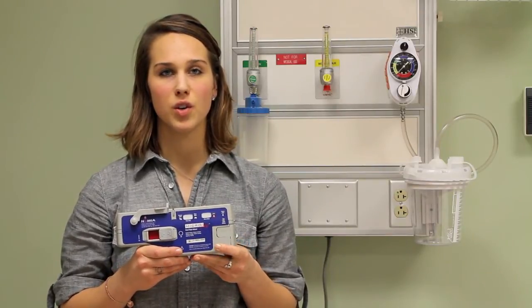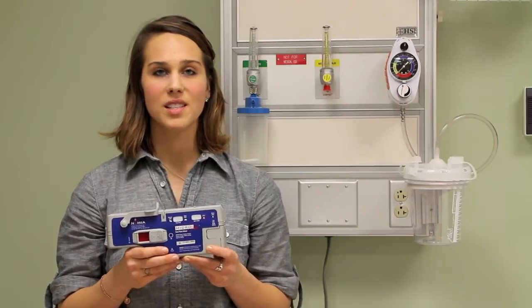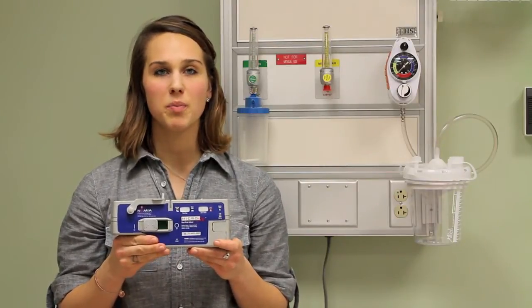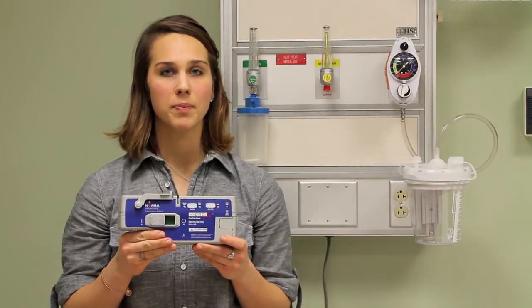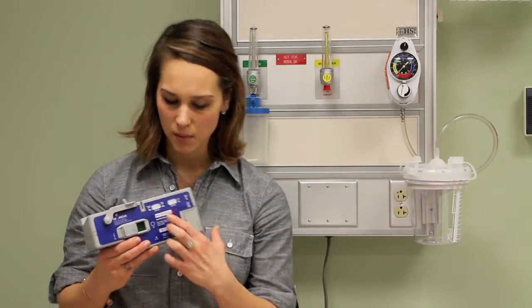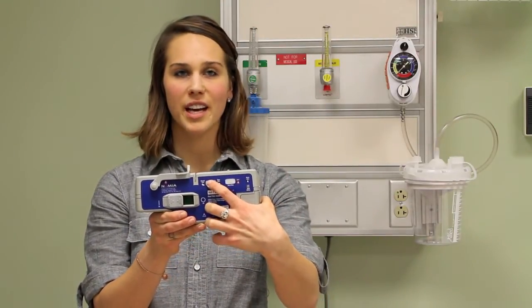Each Microfuse pump has two rates for infusion: normal, indicated by the rabbit, and slow, indicated by the turtle. First, slide the on-off switch to the on position. The rate at which the pump has been set will light up. To change the rate, depress and hold the flow rate button for three seconds until the other light flashes.